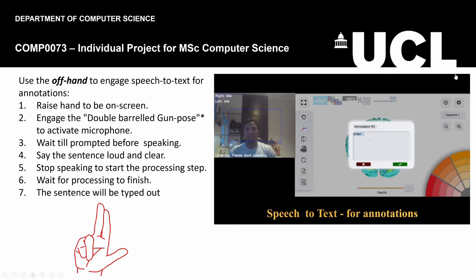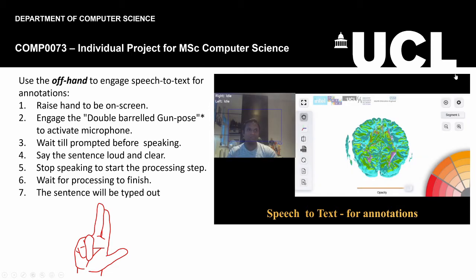There is a tumor in the frontal lobe. And there you go, you can see it working there. So currently this is using Google Speech to Text API, but hopefully in the future this can be expanded to include offline solutions as well.